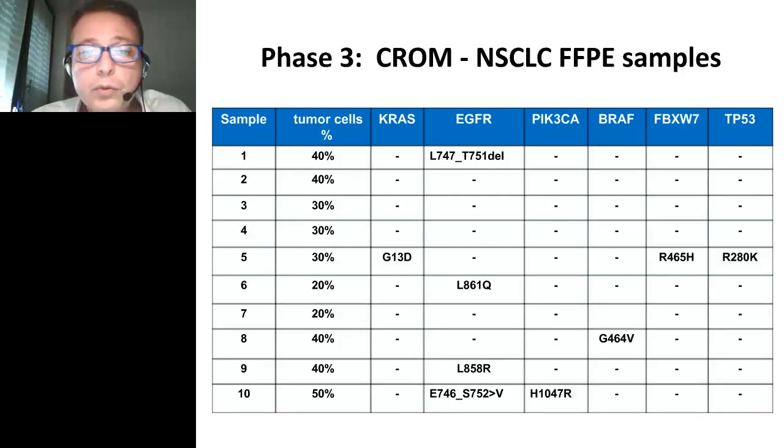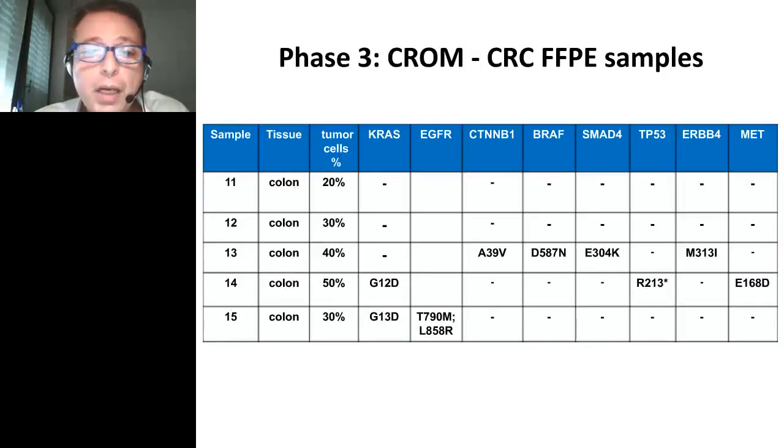First, from what we know, at least from lung carcinoma, usually KRAS and EGFR mutations are mutually exclusive. In addition, EGFR mutations are very rare in colorectal carcinoma, and so we were really surprised to find 2 EGFR mutations in this sample. I have to say that when we saw these results, we really thought that this could be an error of the panel, so it could be a false positive. However, my postdocs were able to confirm the presence of both the T790M and the L858R mutation in this case, so confirming again the absolute specificity of the test.